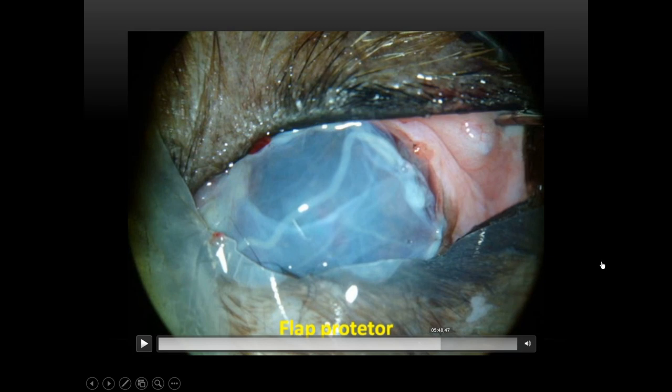Katerina is asking, why is it important to remove the bubbles between the amniotic layers? Because if you do not do so, they tear off easily. Okay, so you'd better do that. Otherwise, you can just fall off quicker.